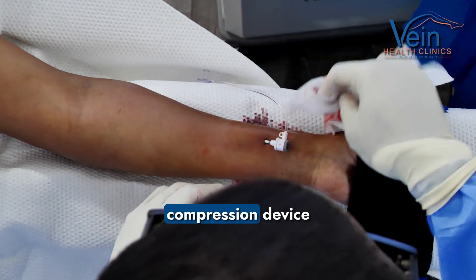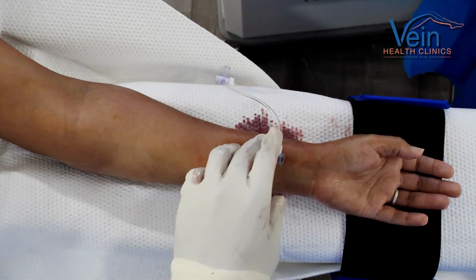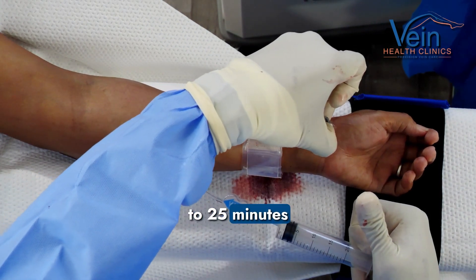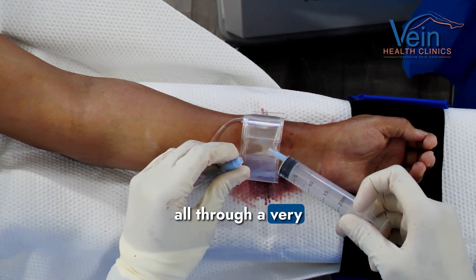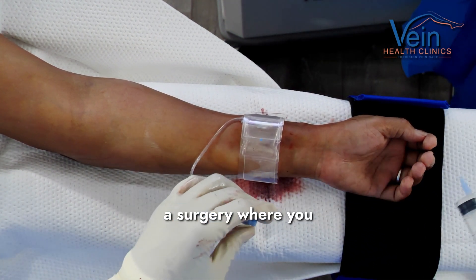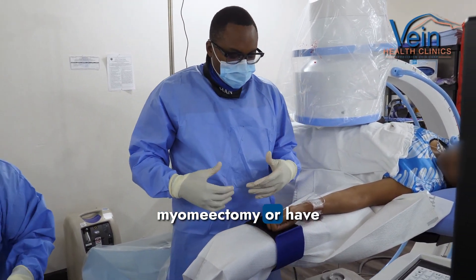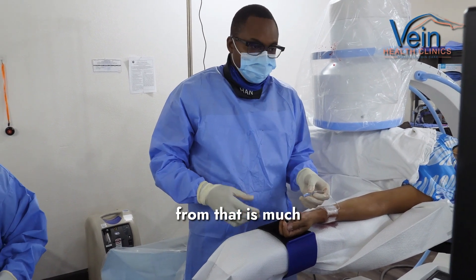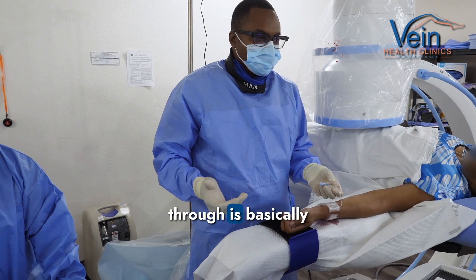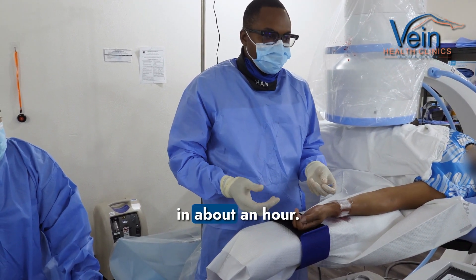Once the radial compression device is taken off, the patient could pretty much go home with pain medicines. This whole procedure has taken us about 20 to 25 minutes, all through a very tiny pinhole access in the wrist. This is compared to surgery where you could have an open myomectomy or a laparoscopic myomectomy, and the recovery from that is much harder. You can see that the person is completely awake — she could hear everything I'm saying. We've gone through a very small vessel in the wrist, just like putting in an IV line, and she'll go home in about an hour.